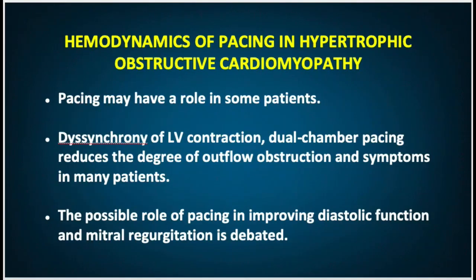Let's move on to the hemodynamics of pacing in hypertrophic obstructive cardiomyopathy. Hypertrophic obstructive cardiomyopathy represents a special situation for which pacing may have a role in some patients. These patients have obstruction to the left ventricular outflow tract caused by hypertrophy of the interventricular septum, typically in the subaortic valve area, combined with systolic anterior motion of the mitral valve.